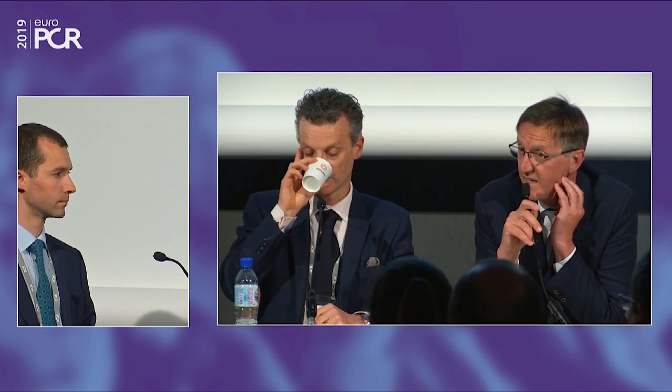There are other situations where you can use this imaging. The disease is often in the bifurcation, and the carina, the flow divider, is often disease-free. That means that the calcium sits opposite to the side branch. If you predilate in this region, we see in the OCTOBER trial that only ballooning will make the balloon bulge into the side branch, and you don't modify this chunk of calcium opposite to the side branch.